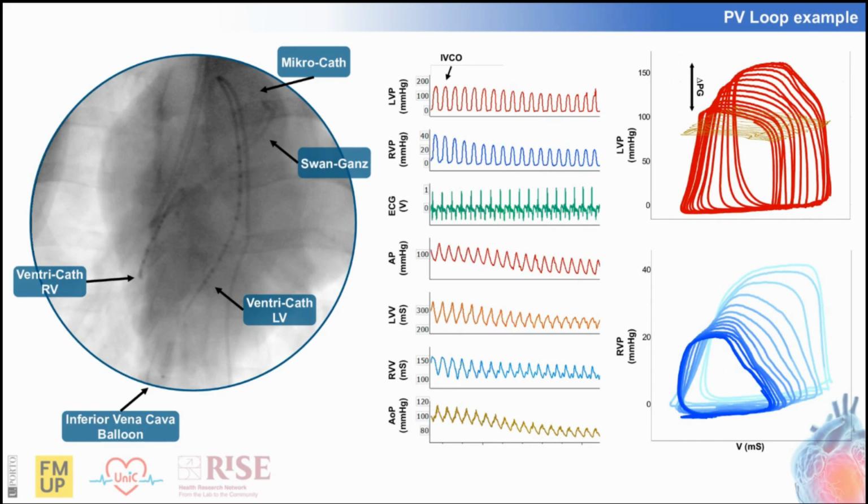With the correct setup, you can easily collect all of these data simultaneously and significantly shorten your recording time if biventricular function is of interest to you.